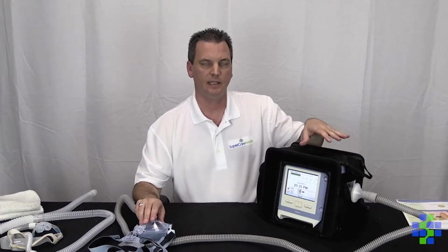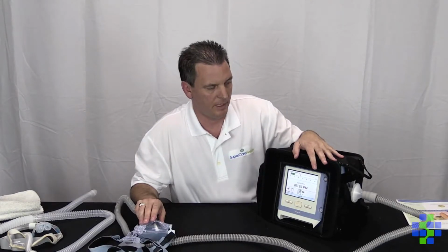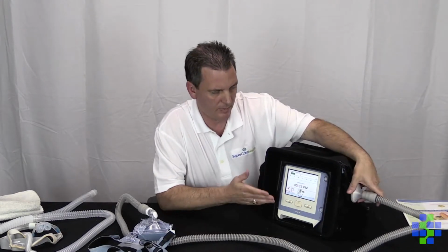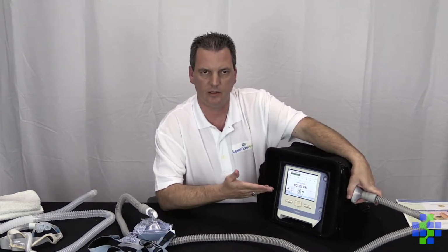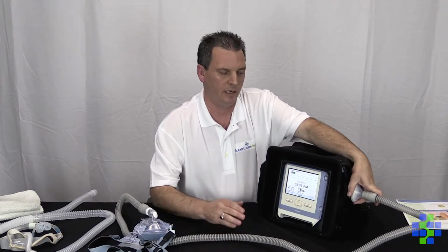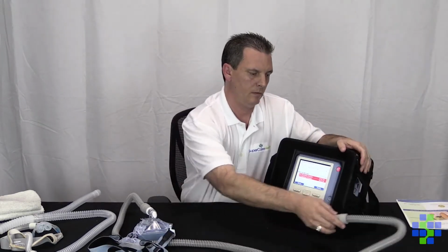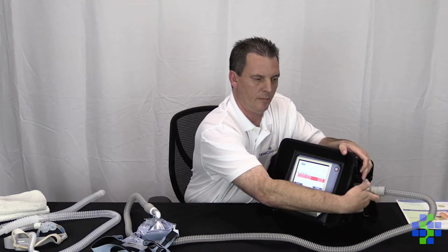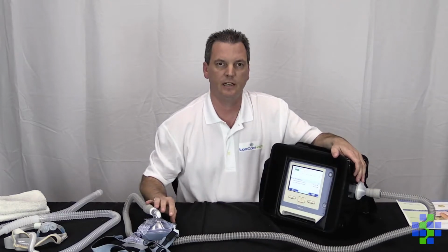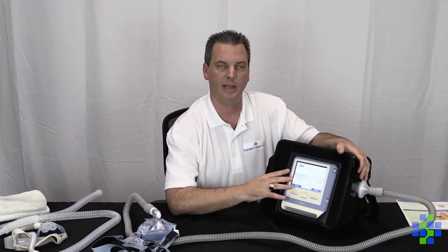At times, you may see an alarm on your screen, and so I'm going to show you what to do in the event that you see an alarm. Sometimes people will disconnect this, and they'll see an alarm, or they might see an alarm because there's a leak of some sort. So anytime you see an alarm, we want to make sure that it's connected, first of all, or find the leak or find the disconnection so that we can stop the machine from making noise.